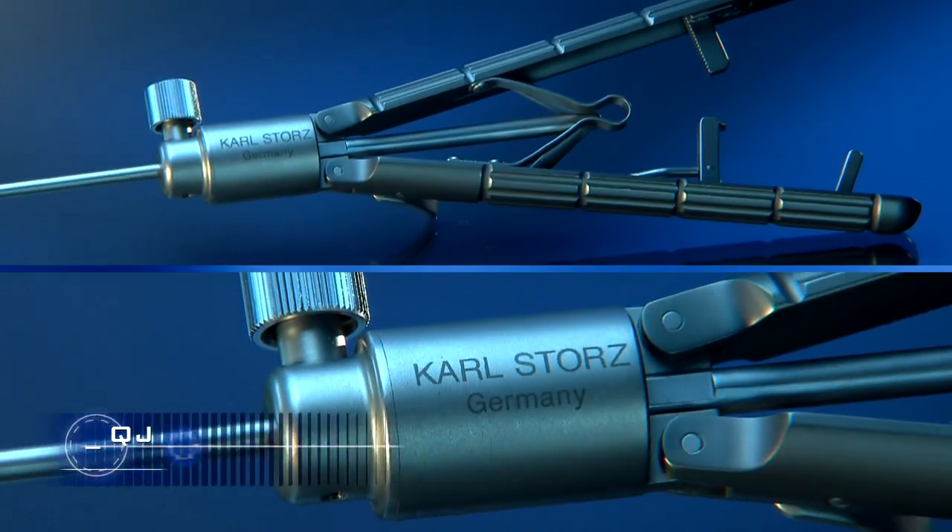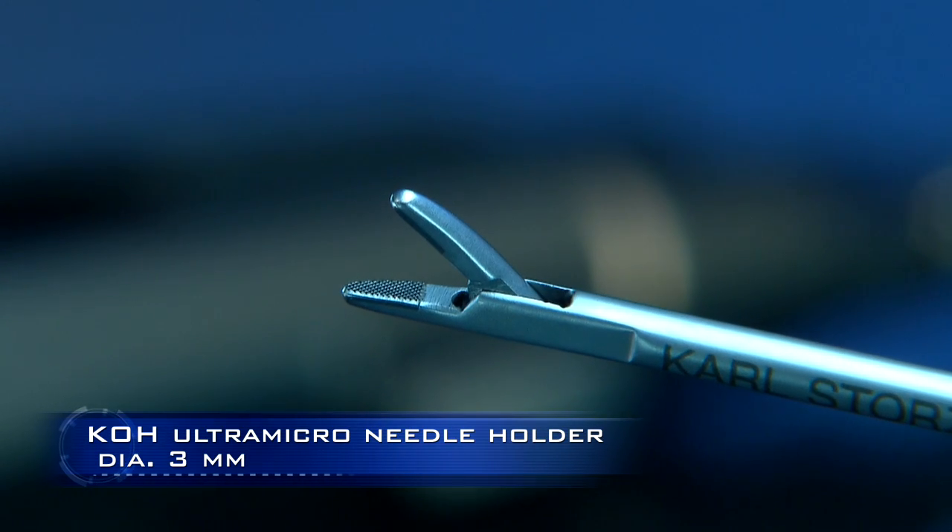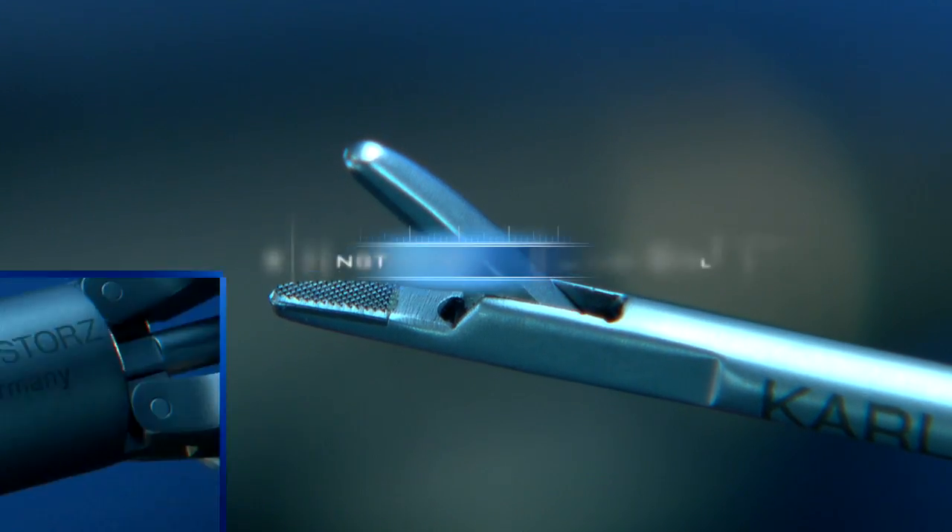Needle holders are already established favorites in adult surgery, so of course they had to be included in this 3mm set.